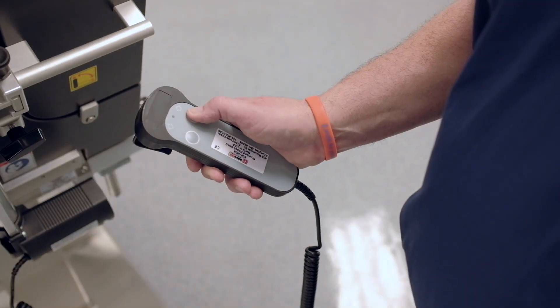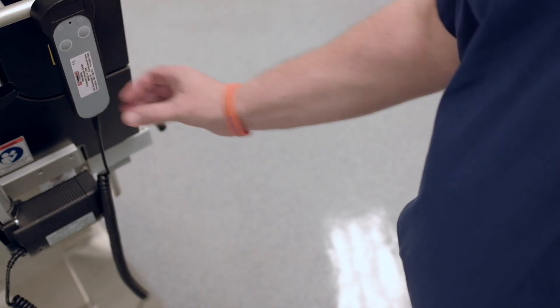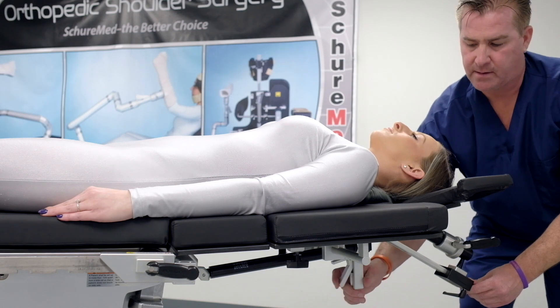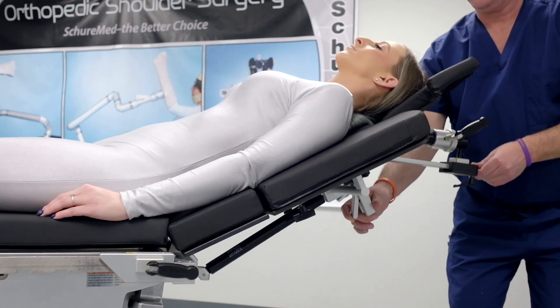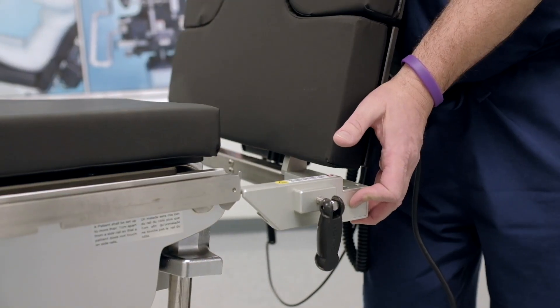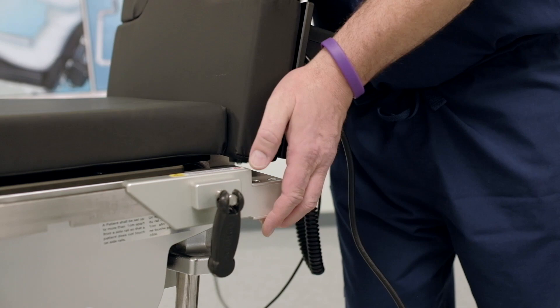Motion control technology eliminates manual patient positioning with a simple push-button hand control. Alternatively, our manually operated beach chair can be easily controlled with one hand. The beach chair attaches to any operating room table with our integrated adjustable mounting clamps.